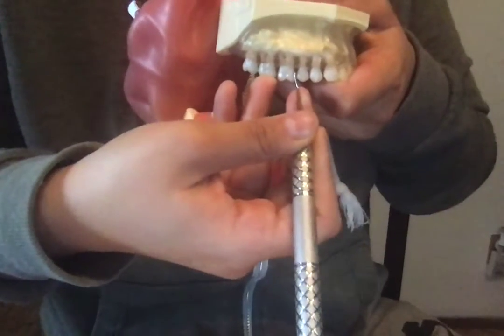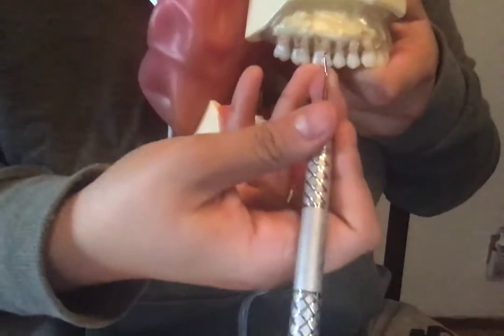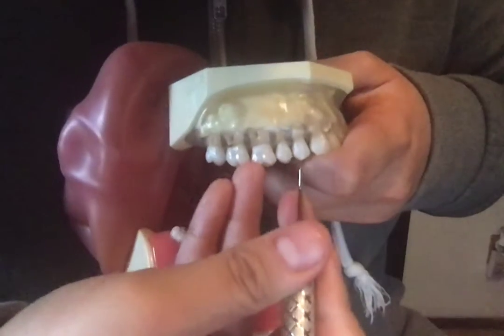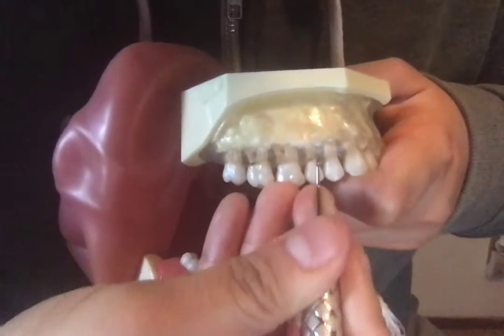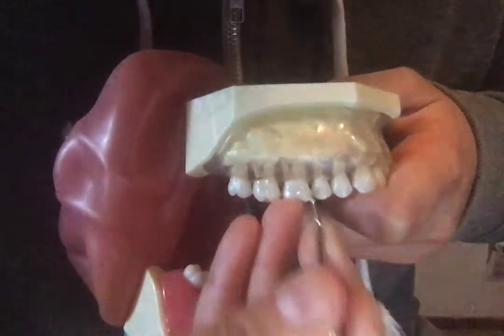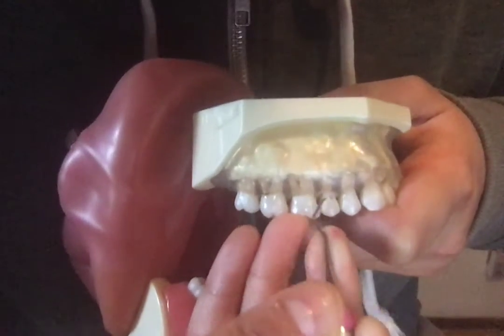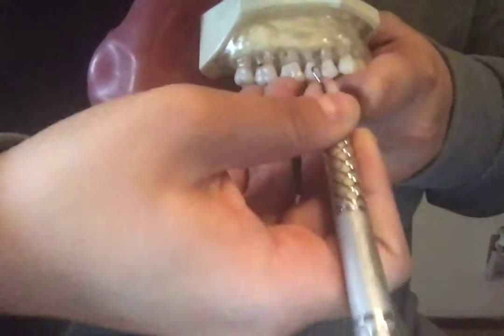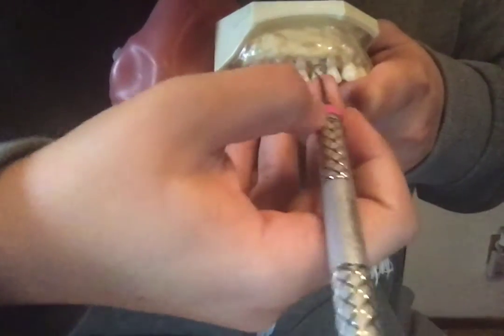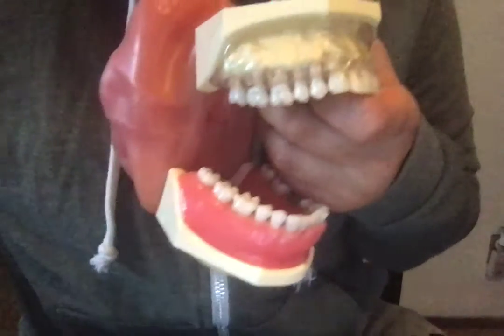When you're working on the maxillary teeth, make sure that your wrist is upwards — it shouldn't be out or to the side, it should be straight upwards on your fulcrum. Always make sure for adaptation that you are using the toe third of the working end. So you insert, open, rock, switch — insert, open, and rock and roll the best that you can. Always remember to be using your wrist for rocking and your fingers for rolling. You would also do the palatal for that side.